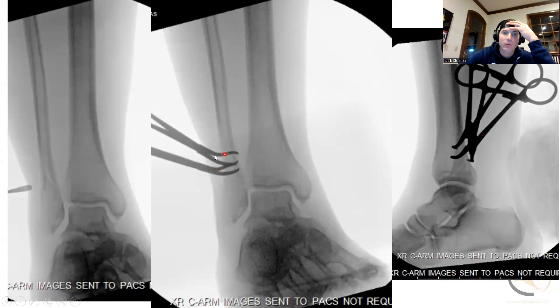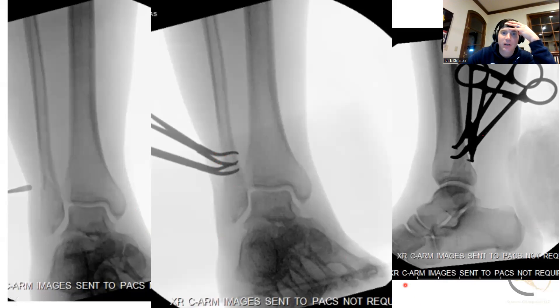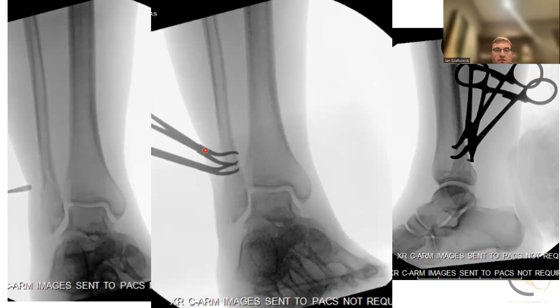Similar approach where I'm using those same clamps to fix this, but I went ahead and used an intramedullary nail to fix this ankle fracture. I had some pretty good x-rays showing the step-by-step process. I did make an incision — contrary to what they'd been talking about with doing it all percutaneous. I'm making an incision and putting clamps on the fracture because I want that lined up, similar to like a subtrochanteric fracture — that's kind of how I see it.